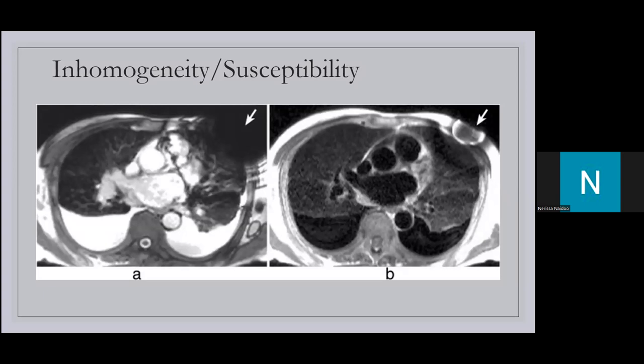Basically, these are susceptibility artifacts, which are a result of the B0 inhomogeneities, coupled with the medical device in place as well. This is an insertable cardiac monitor in axial plane, and we are seeing an image of just the great vessels just above the heart. The banding artifacts are less pronounced when you use a HASTE sequence here. Okay? So it's quite significant there. Here, much, much less.